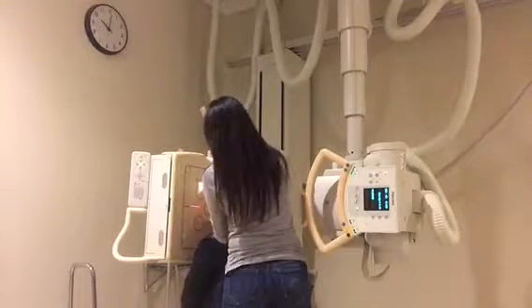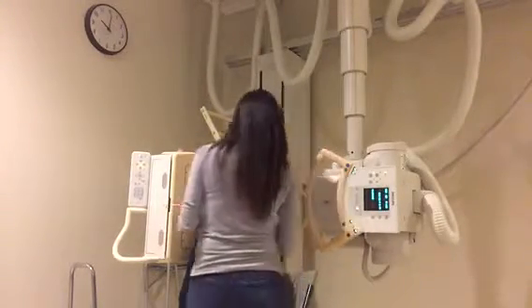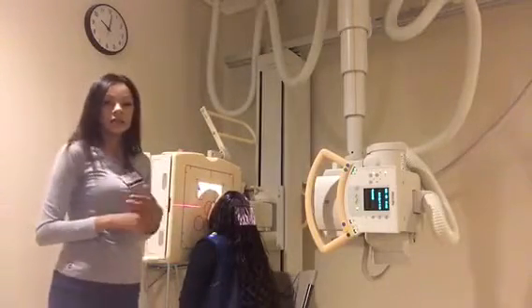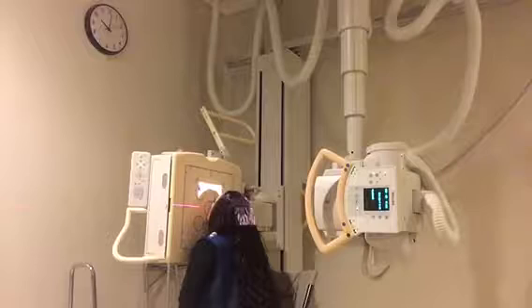Bring your chin back. And again, I'm going to place my left marker indicating that it's my patient's left side. Okay. So go ahead and take a deep breath in and hold it, x-ray.